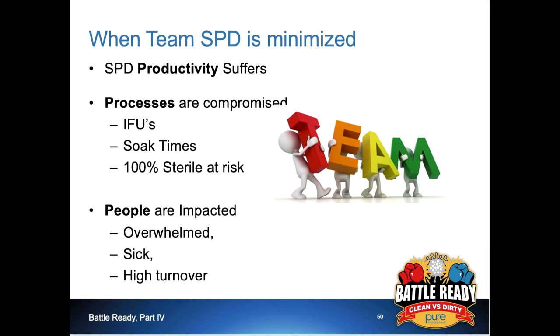However, the decontamination room was the same as it was 20 years ago, both the same footprint, same flow, same amount of equipment. What became obvious was that the dirty area is vital to speedy outcomes. If you're unfamiliar with a dirty area, it's sometimes referred to as the red zone. It's where all the gross bioburden product comes back in from the patient care areas, and instruments are soaked, flushed, sorted, rinsed, and cleaned. It's an extremely labor-intensive area. Additionally, there's a significant amount of staff exposure in this area just based on the bioburden and the volume of instrumentation and devices that are coming down to the dirty area.